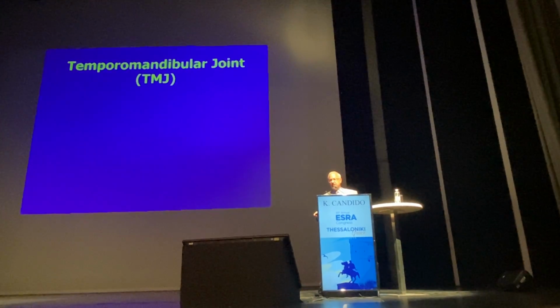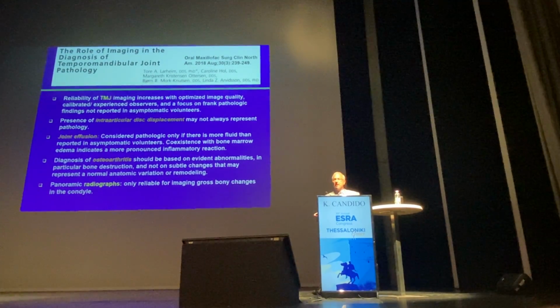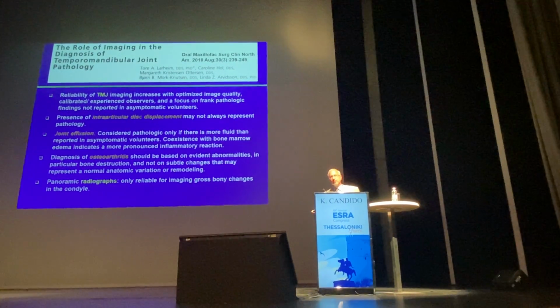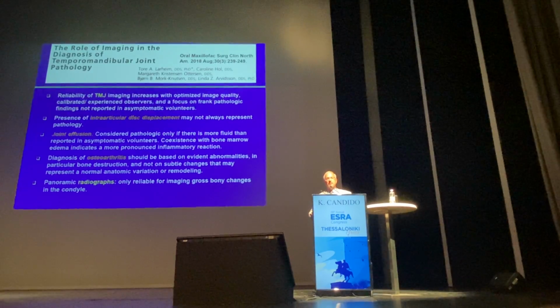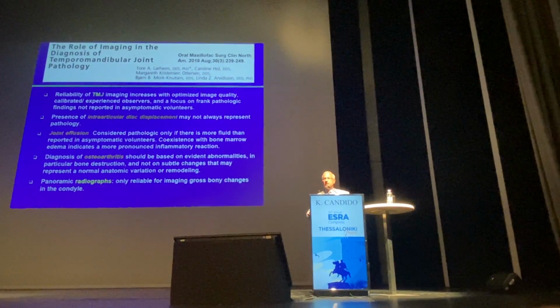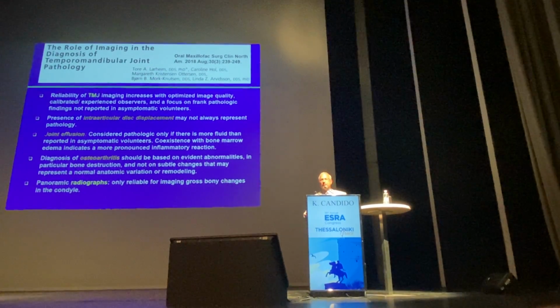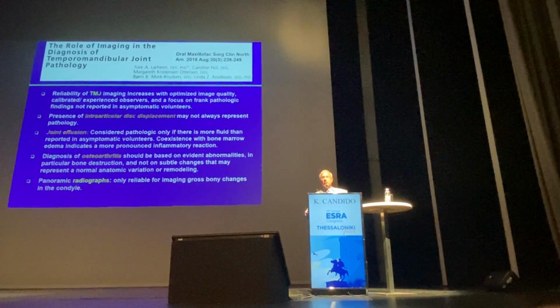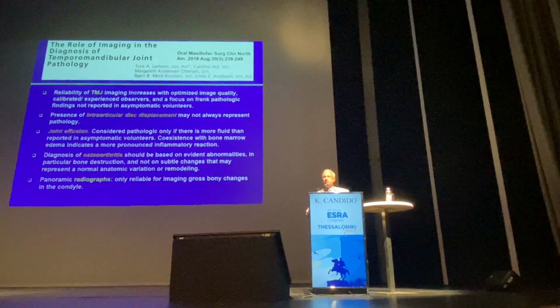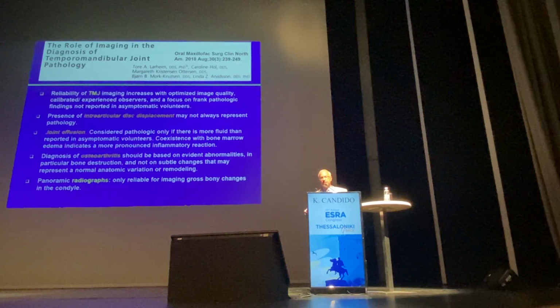Let's look exclusively at the TMJ now. Reliability of imaging of the TMJ has been difficult to prove using prospective studies. There are various modalities available. CT scan imaging, again, MRI remains the gold standard for identifying temporomandibular joint dysfunction syndromes. We also have things like ultrasonography. Again, there's no evidence in favor of or against the use of ultrasonography, but it's cheap, relatively available to most of us who practice chronic pain, and available in most major institutions.